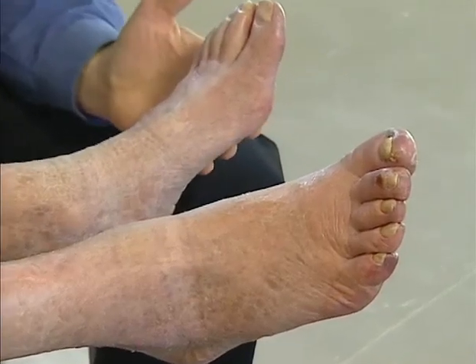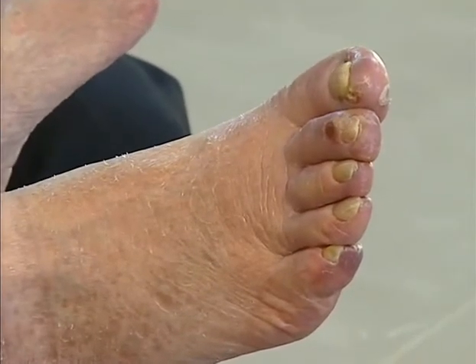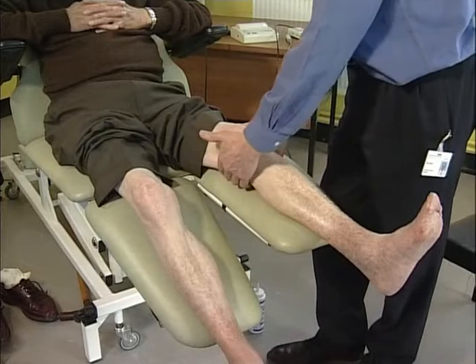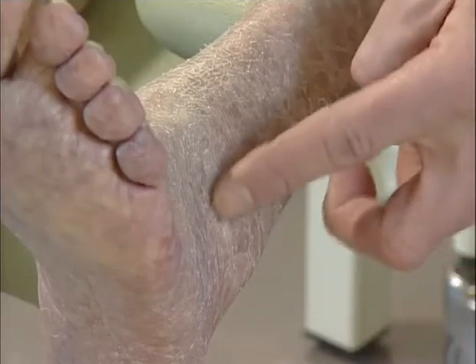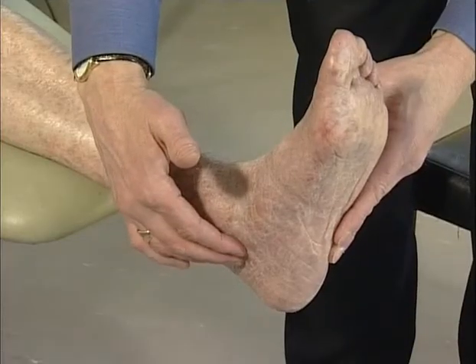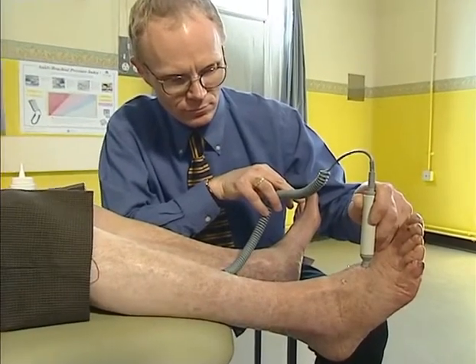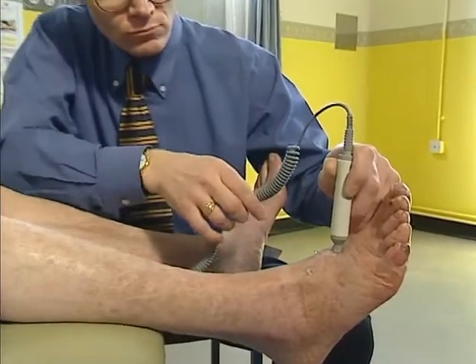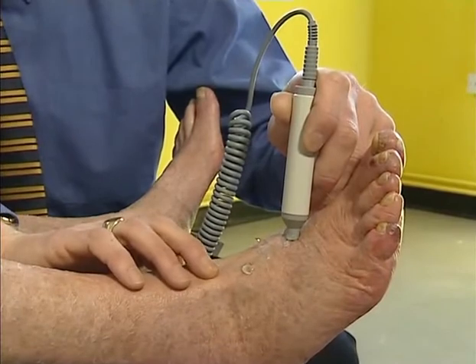All of our arteries, whether we're healthy or otherwise, tend to fur up with age. However, in a patient with diabetes, atherosclerosis is more aggressive, affecting the vessels in the lower leg, namely the popliteal, the peroneal, the anterior and posterior tibial arteries. This results in diminished or absent foot pulses. Here, a handheld Doppler is very useful.